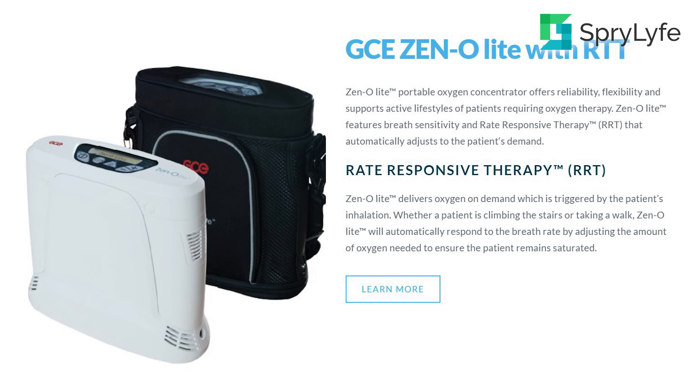Another great feature about the GCE Xenolite is the Rate Responsive Therapy, or RRT. That's where it delivers oxygen on demand. Let's say you're going up a flight of stairs and you end up needing a little bit more oxygen than if you were just walking. The machine will detect that and send you the correct amount of oxygen that you need, catering directly to your breath rate.